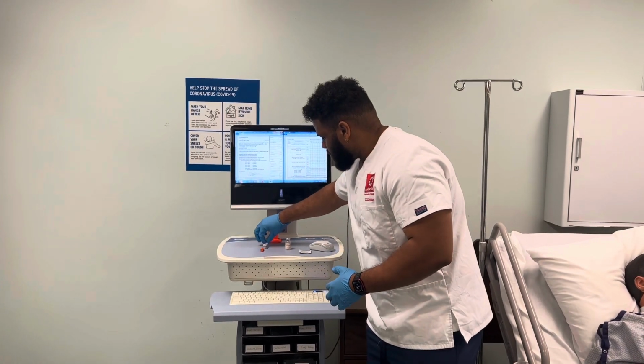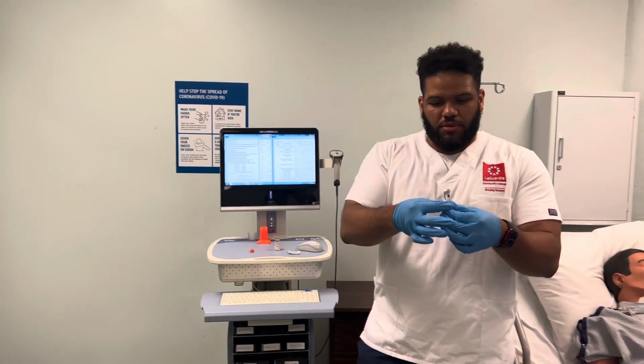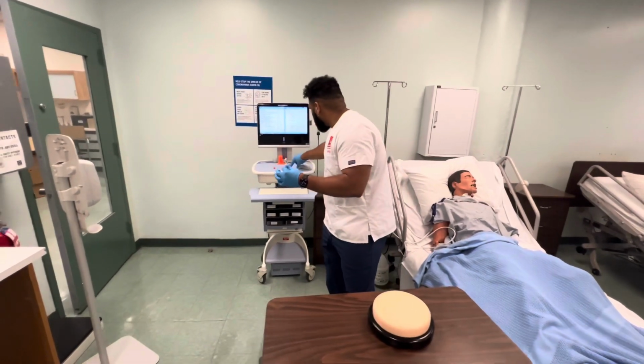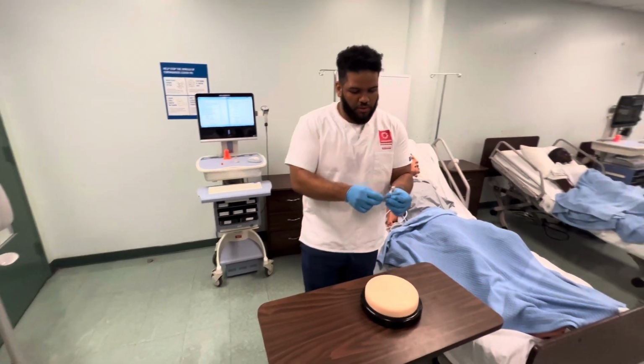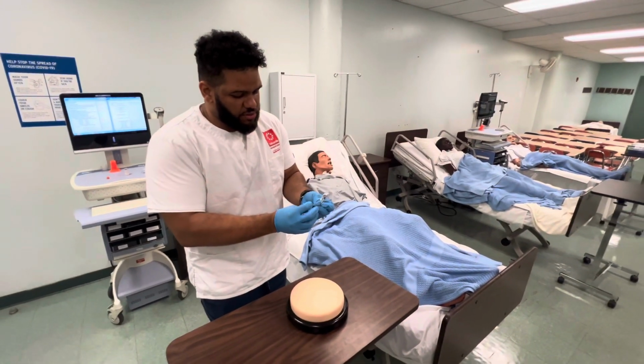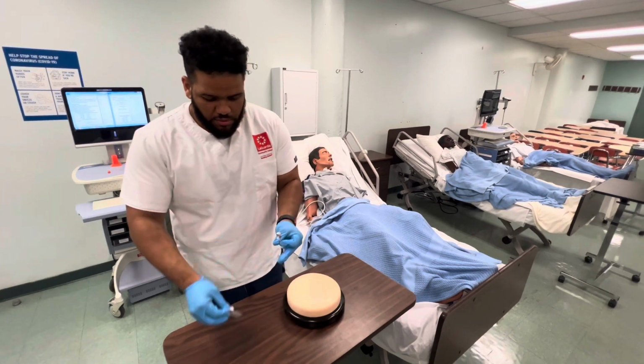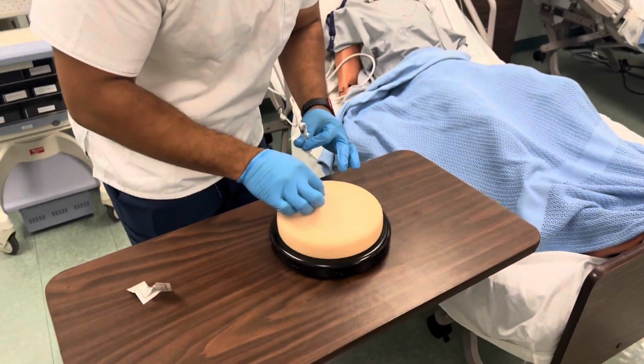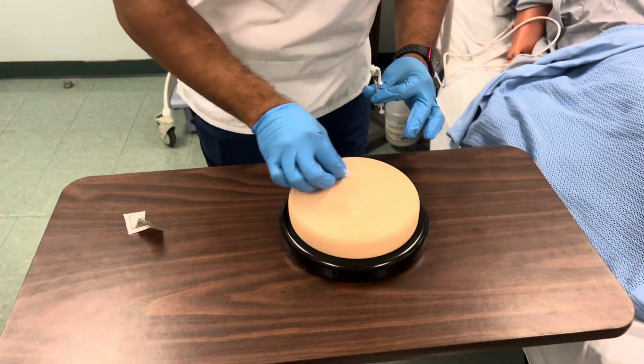So you're going to grab your needle, make sure that it remains sterile, and you're also going to grab your alcohol prep pad, second one, and you're going to sanitize the location in a circular motion from small circle to big circle.